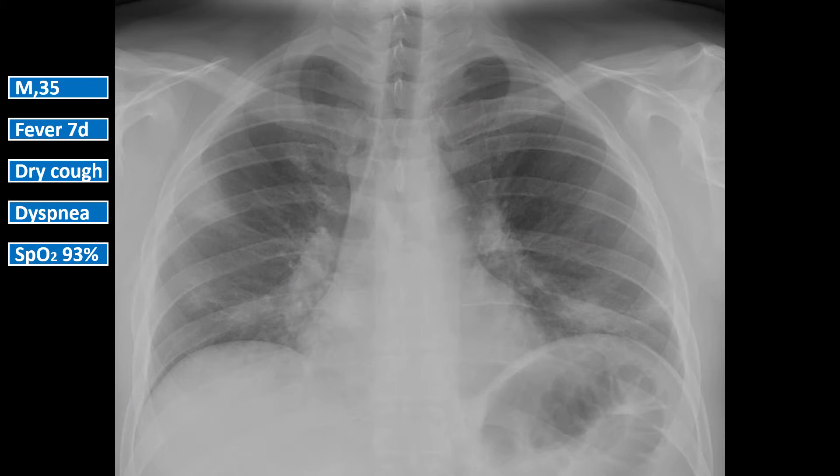Let's take a look at the x-ray once again. There are bilateral opacities, mostly in the lower lobes and the periphery, just beneath the pleura, while the upper portions seem to be spared. This is a typical case of COVID-19 pneumonia.